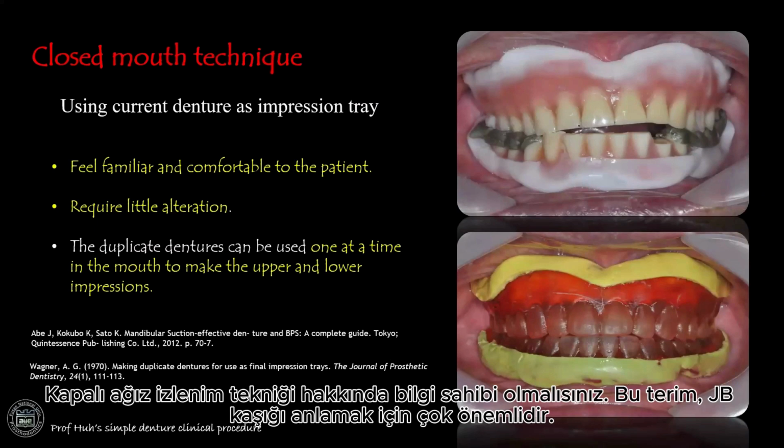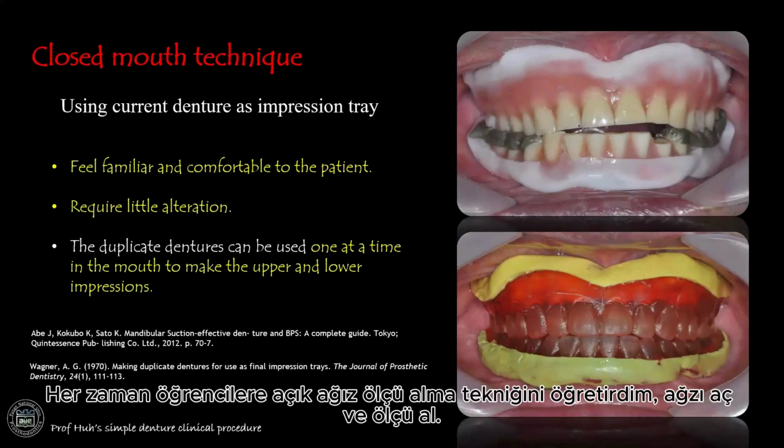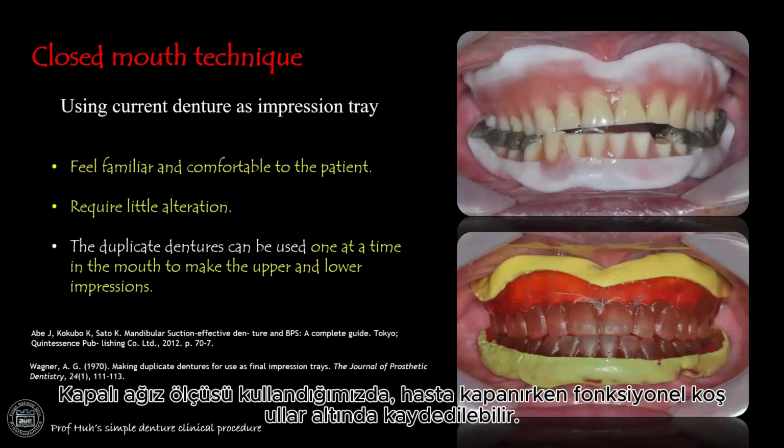I have over 20 years of experience in dentistry, and I have been teaching prosthodontics for over 20 years until now. But I always taught students the open mouth impression technique: open the mouth and then take the impression. But when I use the closed mouth impression technique, I could get high retention and high stability in the lower jaw, the mandibular denture.